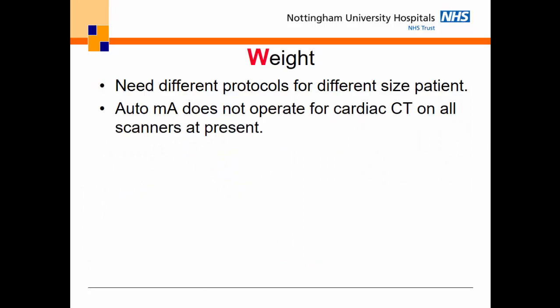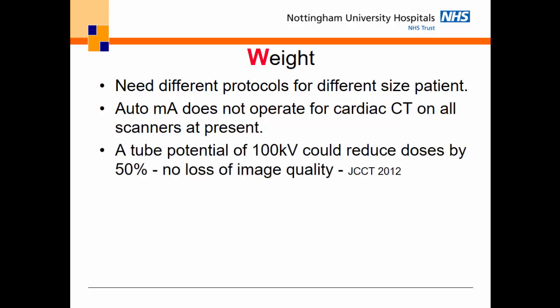On some scanners, Auto mA doesn't operate. Most of them that you buy now would have Auto mA, and it will sort this problem out for you. You need to understand what it's doing, whether it's working, check the samples of images, but once you've got that set up, it will tell you what mA to choose. But not all scanners, does it work for cardiac CT, so you need to check.